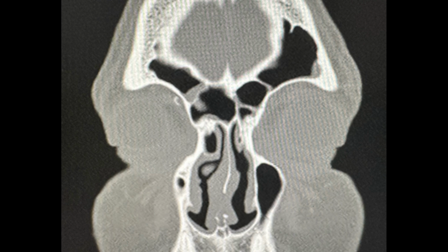And this coronal scan shows you what I was speaking about just before. On the right side, we have a large cell which occludes our frontal sinus and recess, and the frontal sinus itself has opacification, whereas the large cell seems to be clear. On the left side as well, there is a large cell which we saw as the suprabullar cell, which was causing obstruction. The agger on the right side is clearly visible, above which is the large cell that occludes the frontal recess.